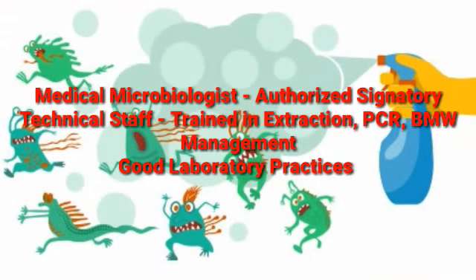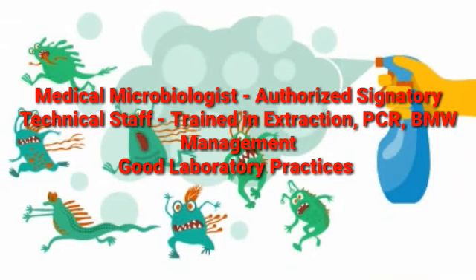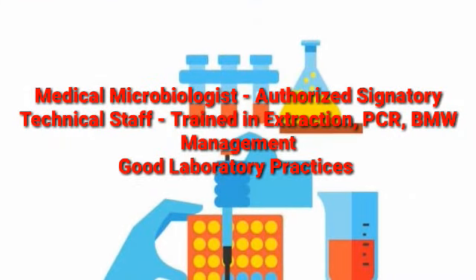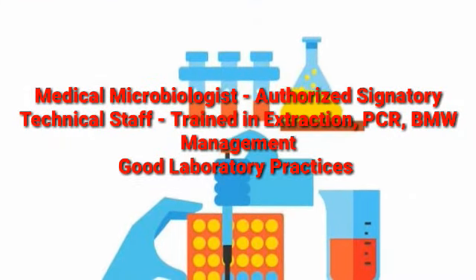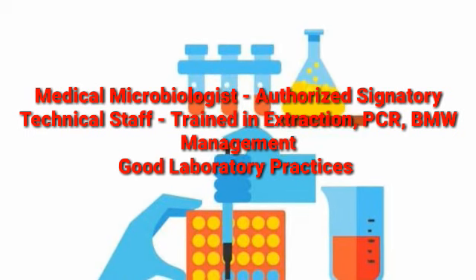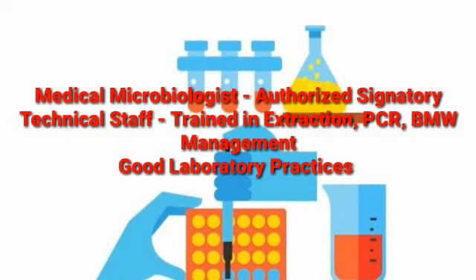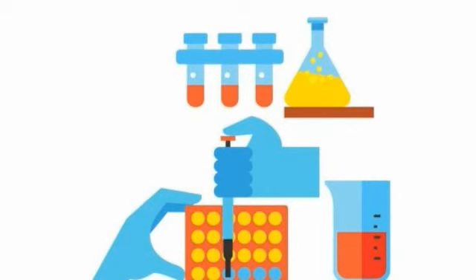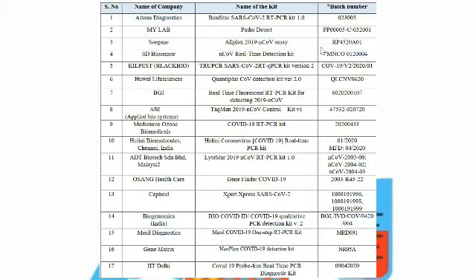Now coming to the manpower requirement, a medical microbiologist is a mandatory requirement for authorization of reports. Technician staff who are well trained in molecular techniques, nucleic acid extraction, and polymerase chain reaction technique are required. The staff must be well trained in good clinical laboratory practices as well as biomedical waste management.